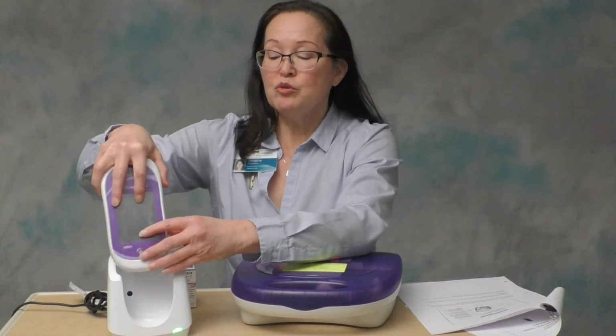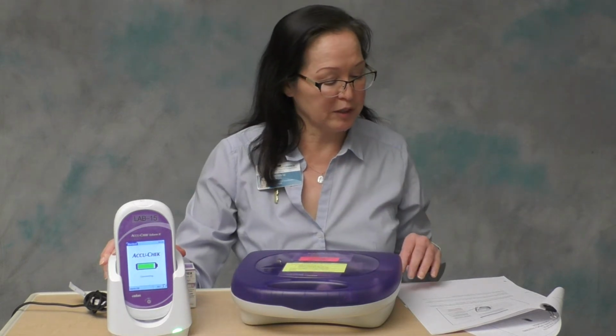If you see a base with a red light, whether it's solid or flashing, you should reset the base. The easiest way to do that is to just unplug the power cord from the wall and then plug it back in again. When you do that, the light will go solid red for about 1 minute and then should switch to green. If you have tried to troubleshoot it and you still have a red light, you should call our office so that we can come up and do additional troubleshooting on the base unit.